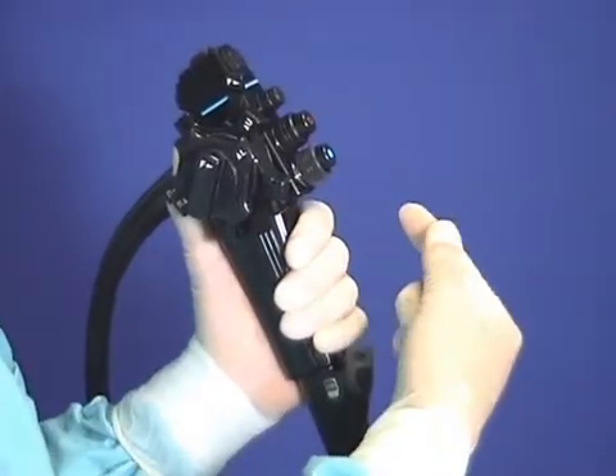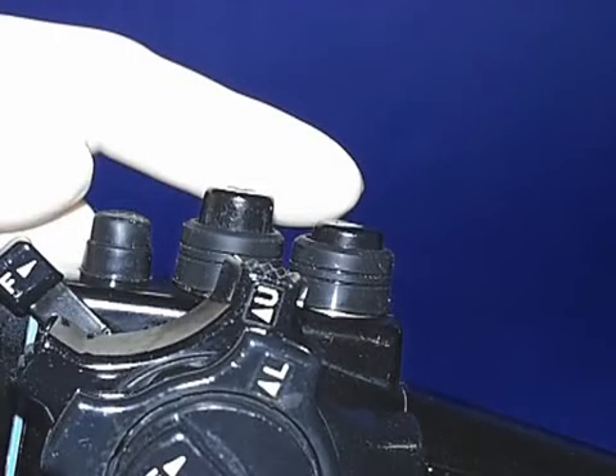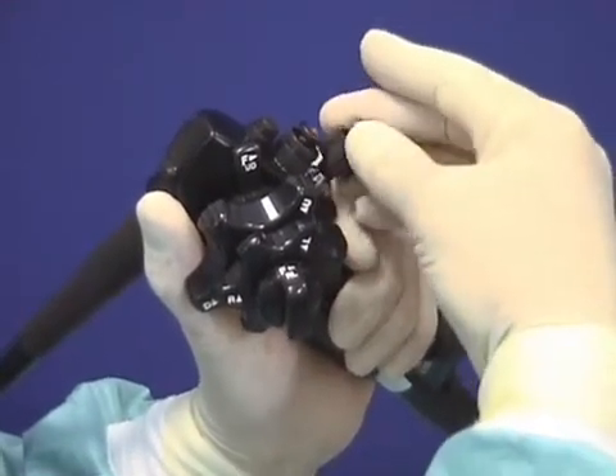Is the air or CO2 valve fully pushed in, or is the button stuck down, needing to be pulled up again and removed for lubrication or a replacement valve fitted?